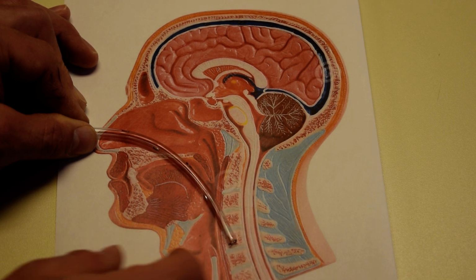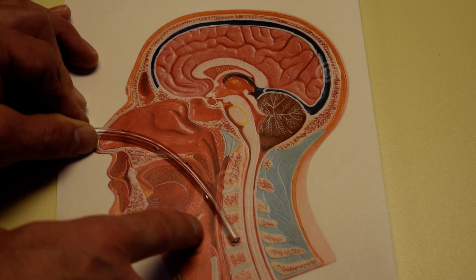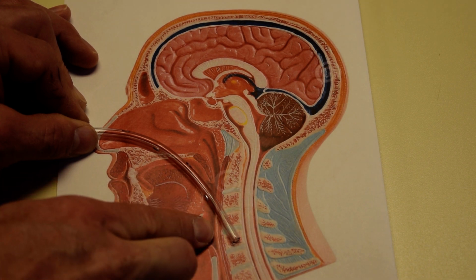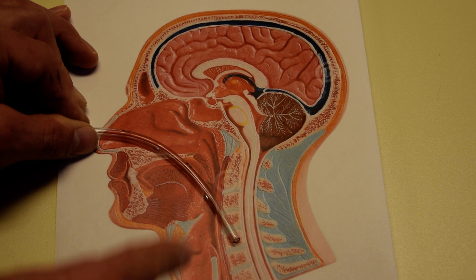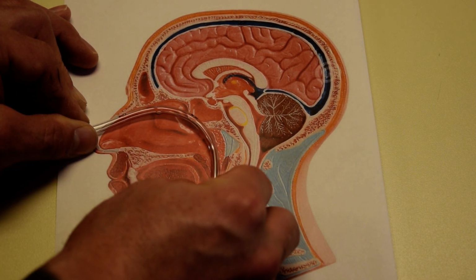So if the patient brings their chin forward a little bit, so you have them bring their chin to their chest as much as possible, what that'll do is it'll actually block away your airway here, and it'll force the tube, once it gets to this point, to go automatically down the esophagus and not the trachea. So that's another tip: bring the chin down to the chest and say that to the patient. You're going to do all of this before you start advancing beyond this first step.